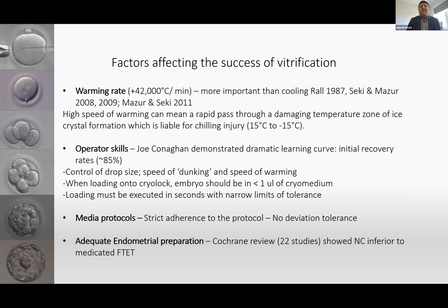Okay, so this is what we achieve in our lab, and of course it's quite important to understand that there is a learning curve. For those of you who are new to vitrification or are training in vitrification, I would highly encourage you to keep the practice going. Look at your data. Once you've done about 50 failed FERT eggs or discarded embryos, then assess what your survival rate is and keep on top of that.